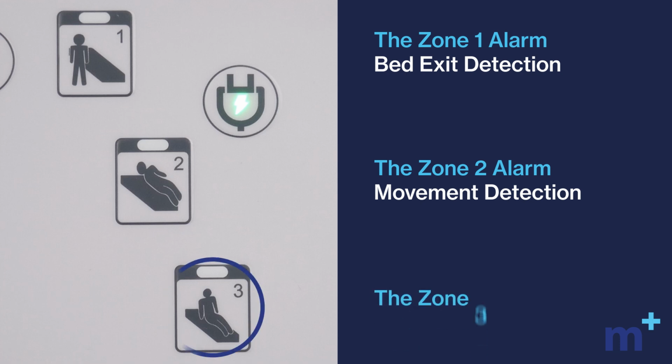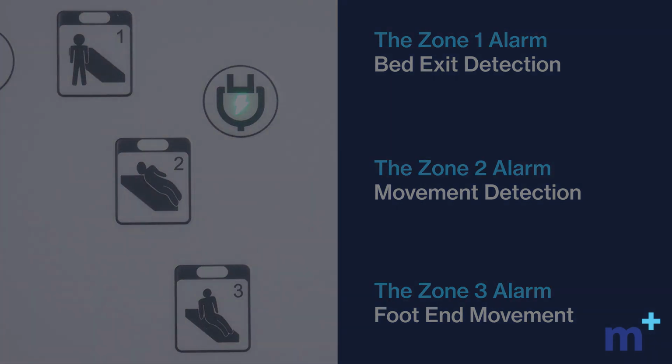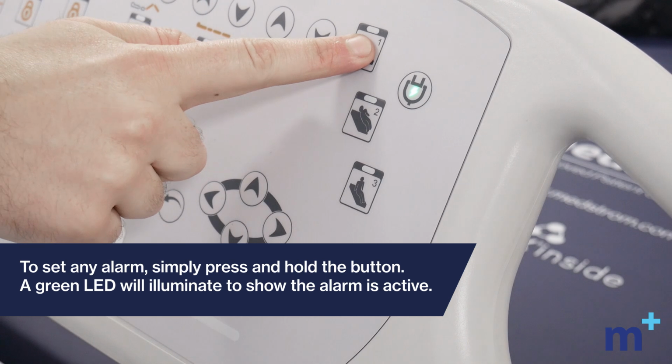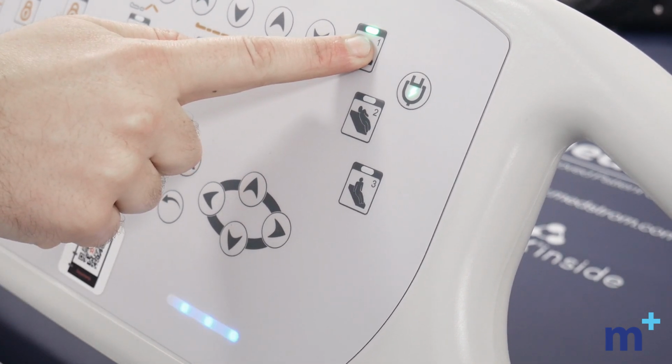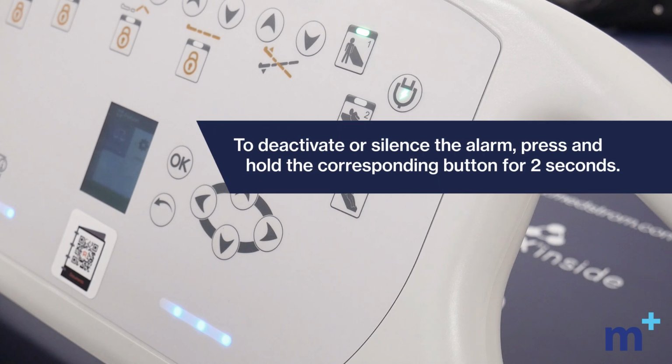The Zone 3 alarm will be triggered if the bed detects a significant move from the patient towards the foot end of the bed. To set any alarm, simply press and hold the button. A green LED will illuminate to show the alarm is active. Please note that the patient must be on the bed to set an alarm. To deactivate or silence the alarm, press and hold the corresponding button for 2 seconds.